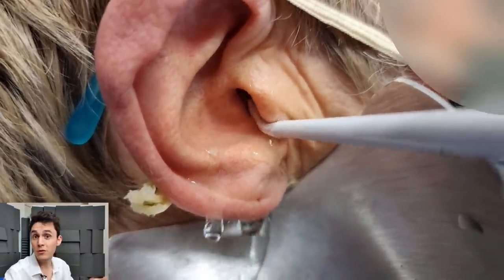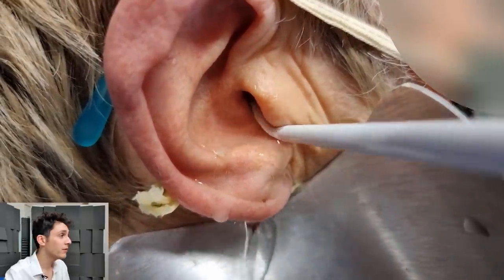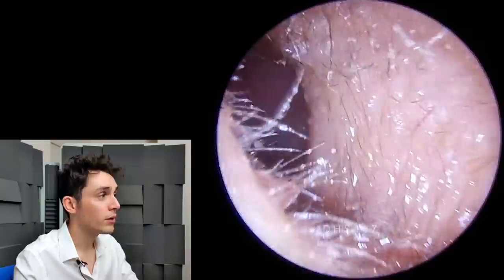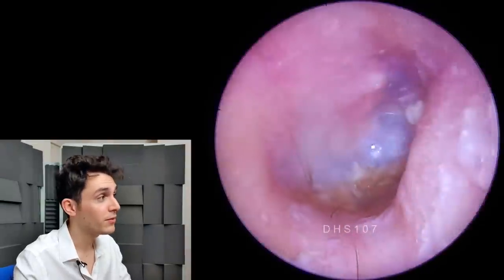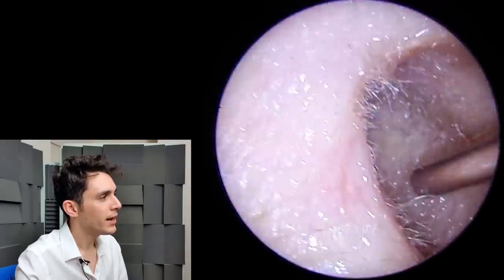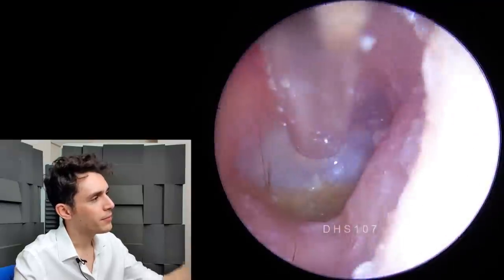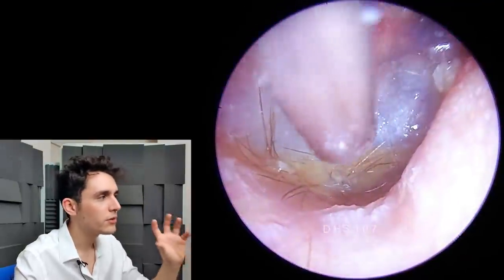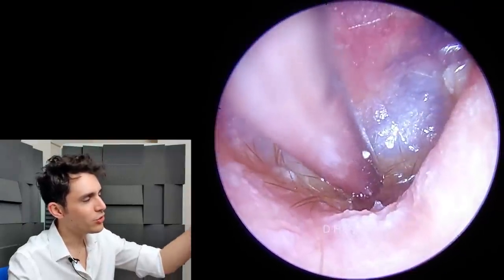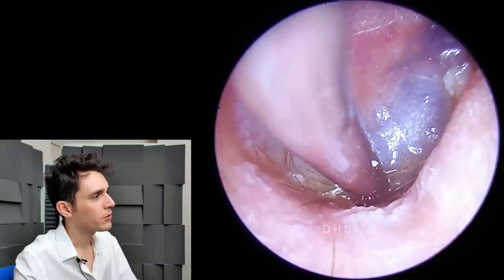It's the same kind of caloric effect you get with suction. You may have heard me or Reese or Neil mention it before — if we're working too close to the eardrum for too long with the suction, we get a cooling caloric effect. Now, just the last little bits here. The Projet has cleared most of the debris, and most of what remains is in this trench — this inferior recess — and we're suctioning up the last little bits.